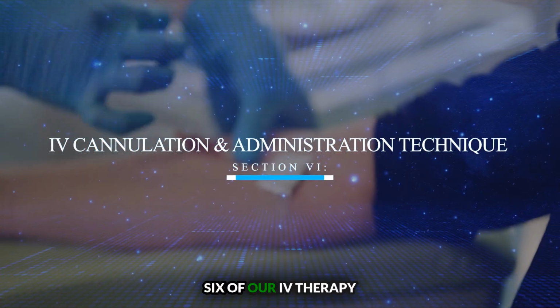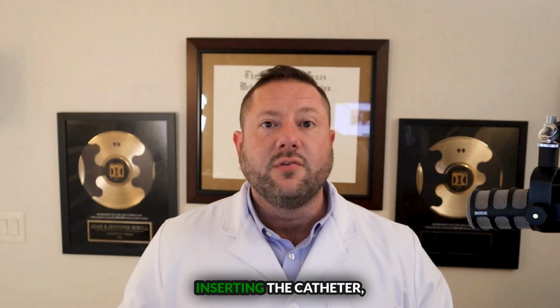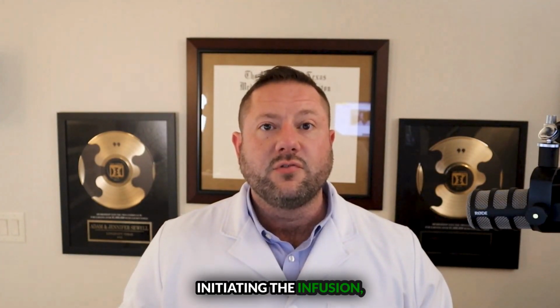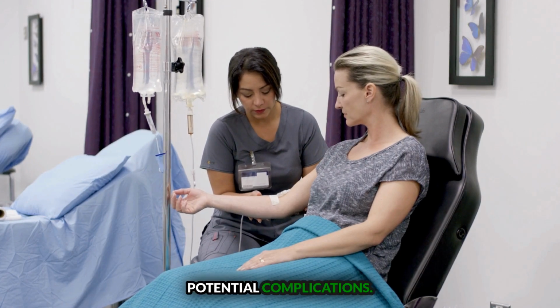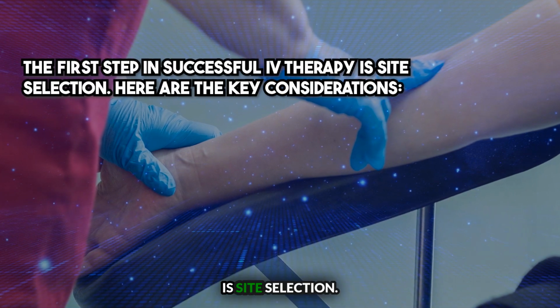Welcome to Section 6 of our IV therapy training, IV cannulation and administration technique. In this session, we'll walk through the process of selecting the optimal IV site, inserting the catheter, initiating the infusion, and monitoring for potential complications. The first step in successful IV therapy is site selection.